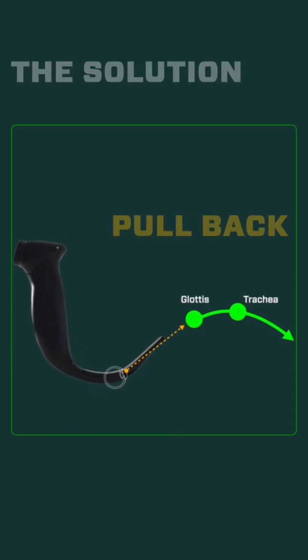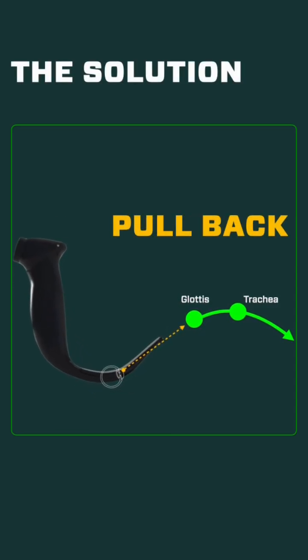The first solution: simply pull the blade back. Don't get too close, and don't get underneath the epiglottis if you don't have to. Seat yourself in the vallecula, pull back a little bit, and that does a couple of things. First, it gives you more of a glide path to the trachea and more room to deliver the tube. Second, it decreases the angle and aligns more with the tracheal axis.